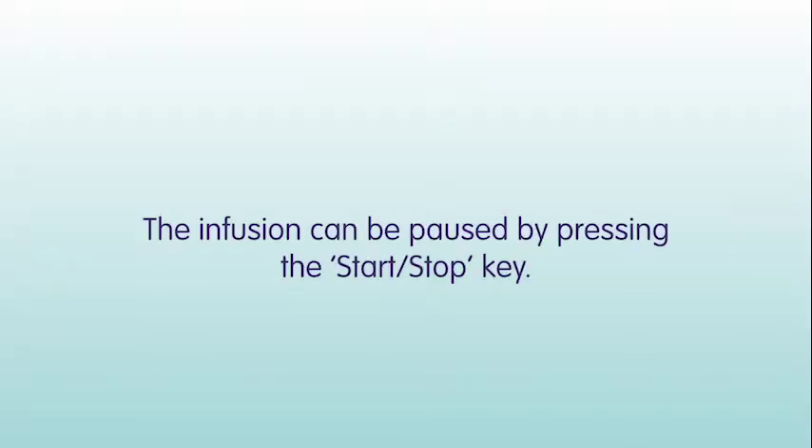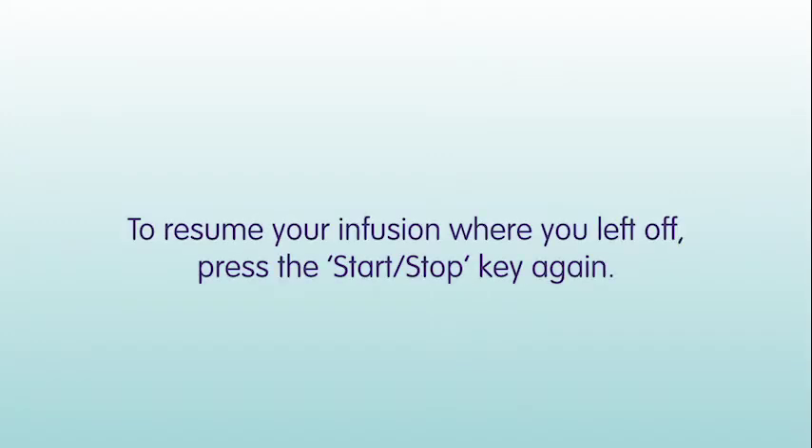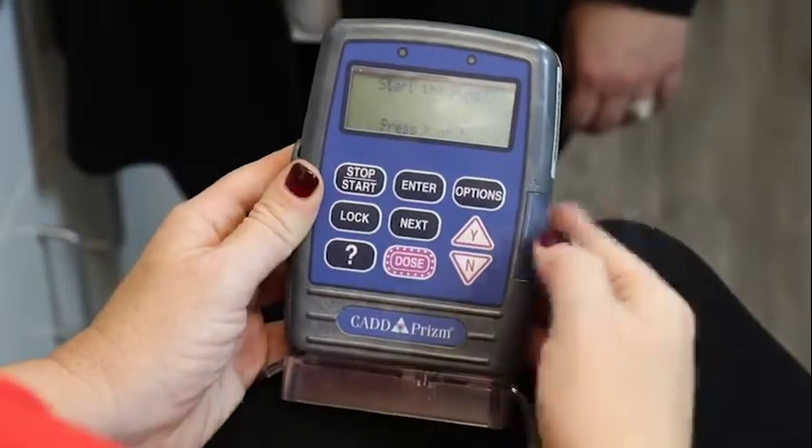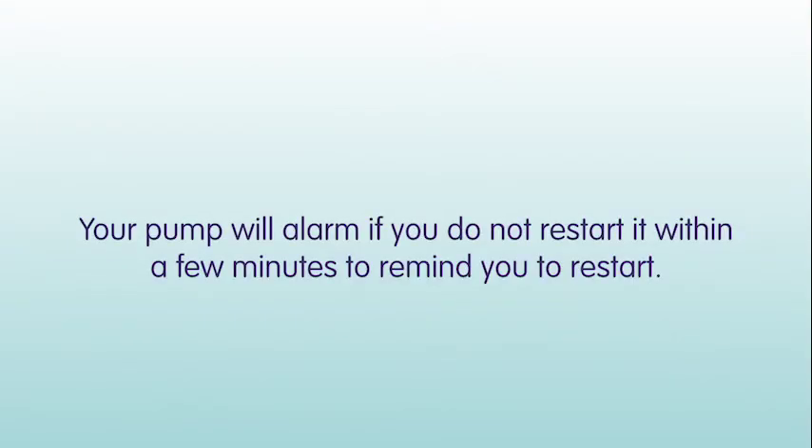The infusion can be paused by pressing the Start-Stop key. To resume your infusion where you left off, press the Start-Stop key again. Your pump will alarm if you do not restart it within a few minutes.